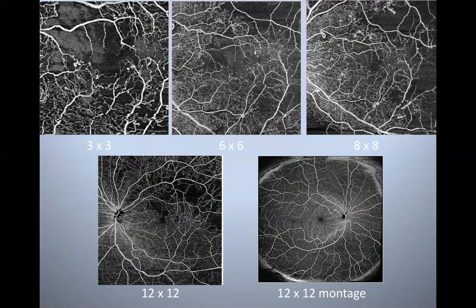We're not looking at fluorescein dye going through the vessels. We're looking at a snapshot in a moment in time of the blood flow in the back of this patient's eye. If I took a picture two seconds later and there were blood vessels perfusing through this area, then that would not be non-perfusion, it would be impaired perfusion. So we can't really call it non-perfusion with one image like this.